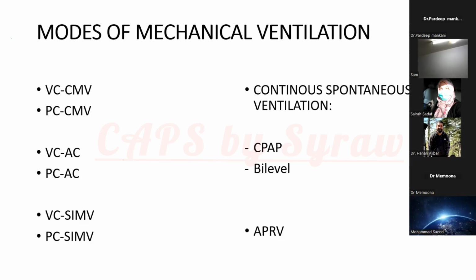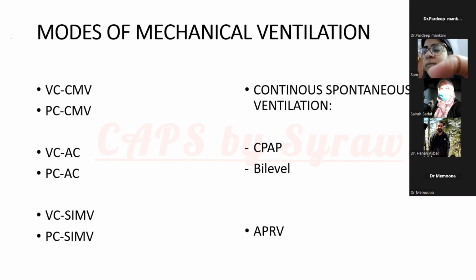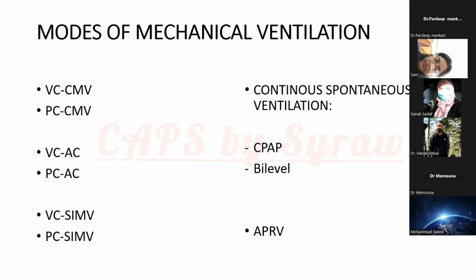The ventilator will sense it and then again deliver a breath very close to that target tidal volume, keeping the airway pressures between the set values that we put into it. So there is less risk of barotrauma, and the minute ventilation is ensured. Both the advantages of VC and PC mode are taken into this mode, and at the same time, the side effects of both modes are avoided.